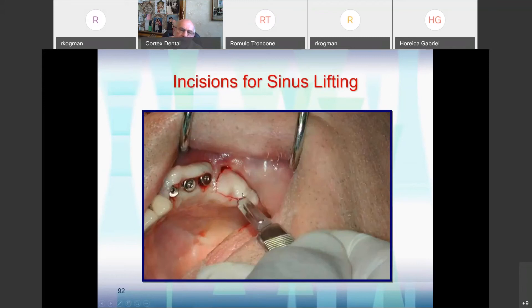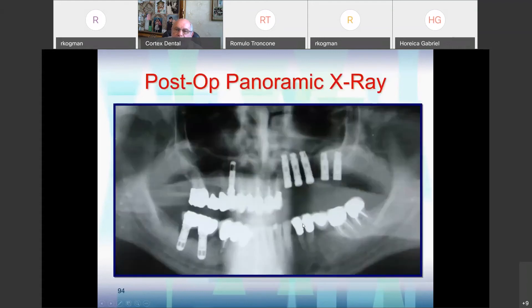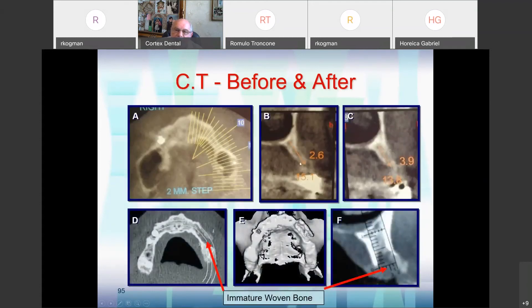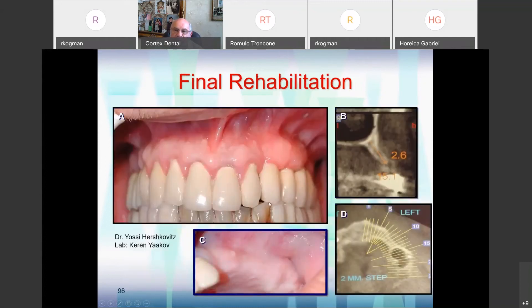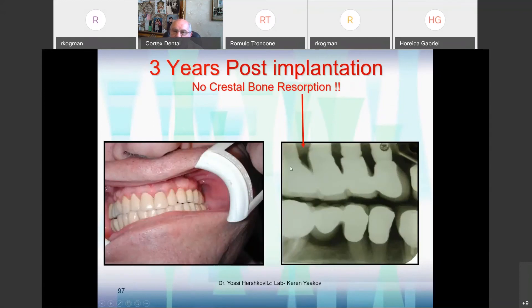You can see we started with a very narrow crest — and look at the width. We have immature woven bone here, which is actually the ideal stage for implants, because you insert the implant at the stage of starting to build new bone, so new bone will build around the implant and the osseointegration process will be shorter. This is the end result, made by Dr. Hershkovitz and technician Keren Yaakov. At three years post-op, you can see no bone loss.